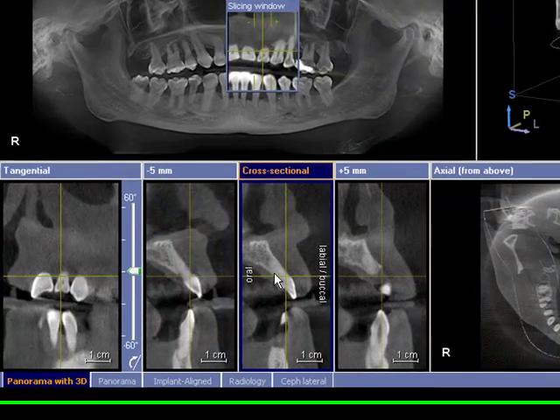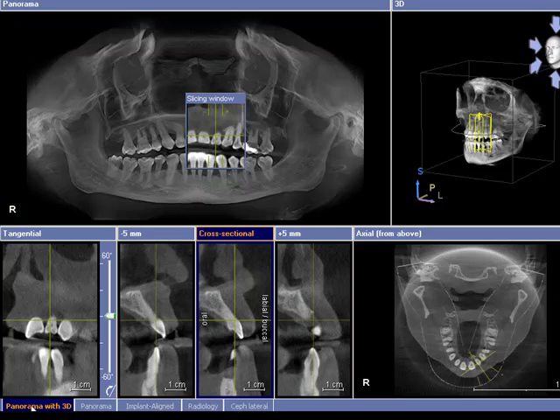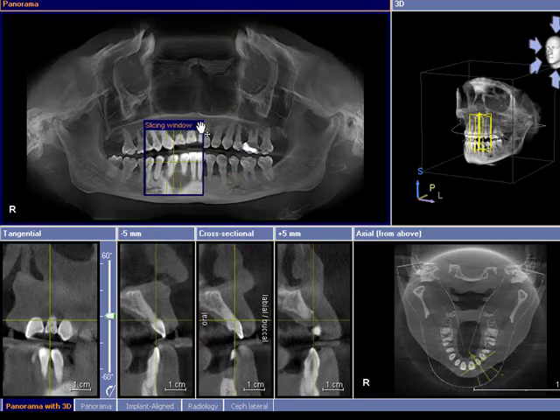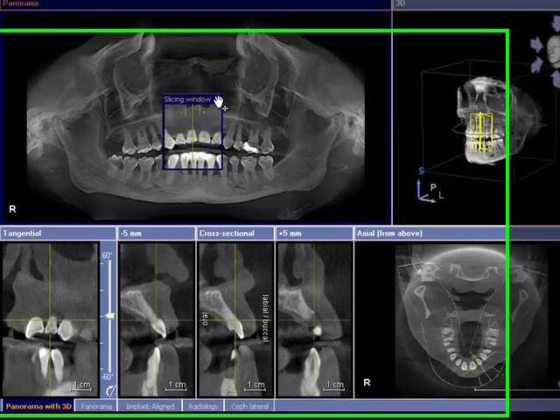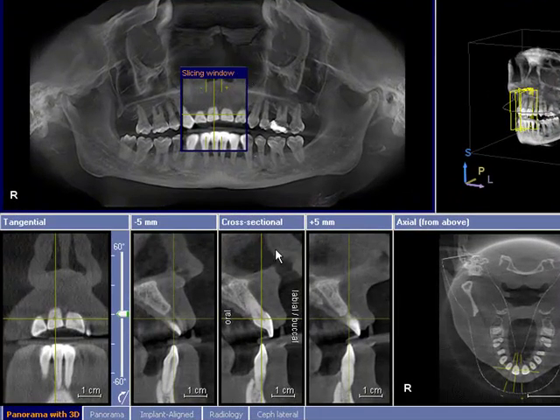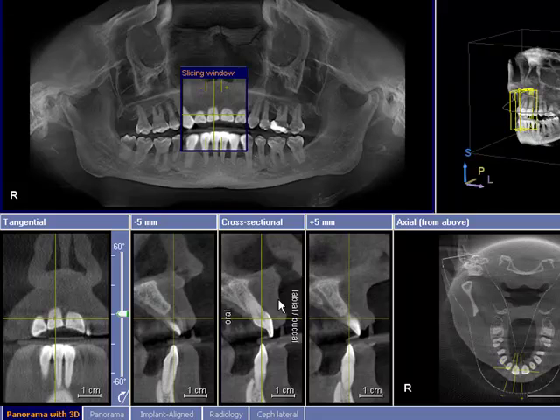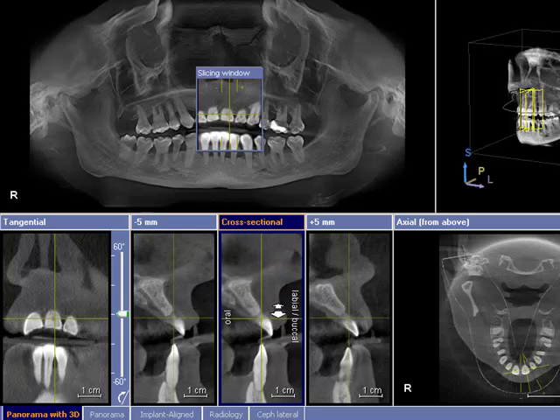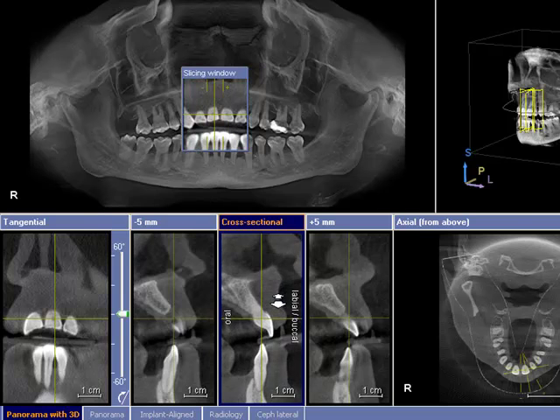Using this panorama with 3D tab you can move your slicing window to any area of interest. Use your cross sections to scroll through up and down — left mouse click and hold — scrolling up and down.